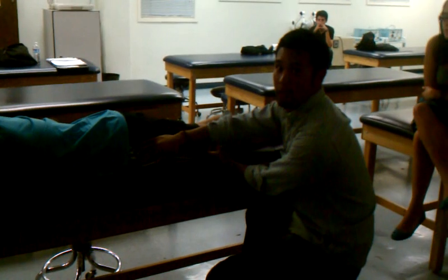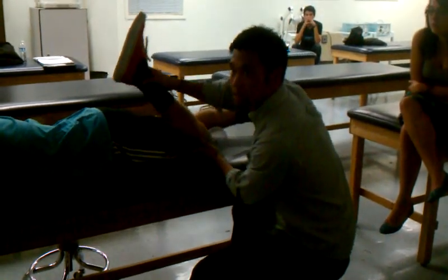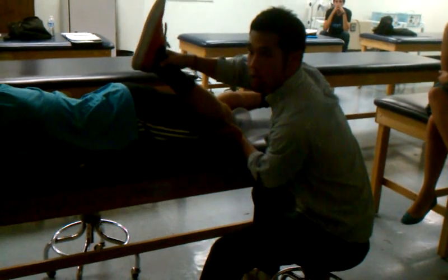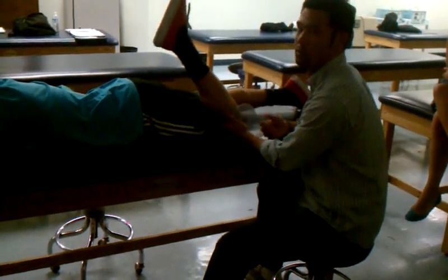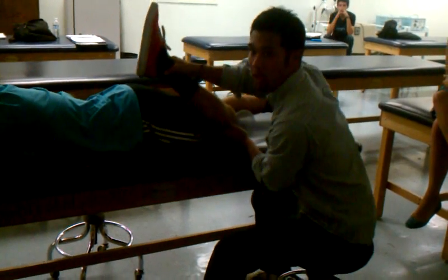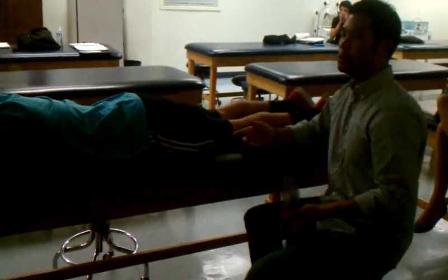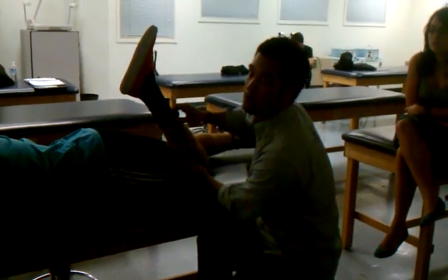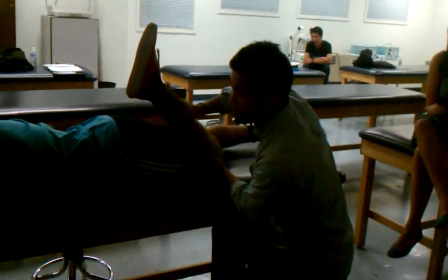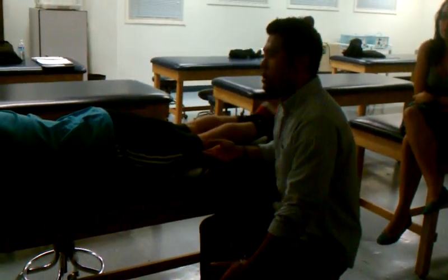I can apply overpressure and have them pull their knee to their butt as far as they can — that's fine, it's not wrong. But I prefer to line it up with the lateral malleolus. That way I can see exactly how far he's able to get. You can do active or passive. Passive supine is more difficult.